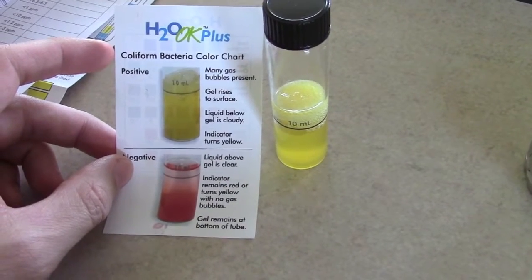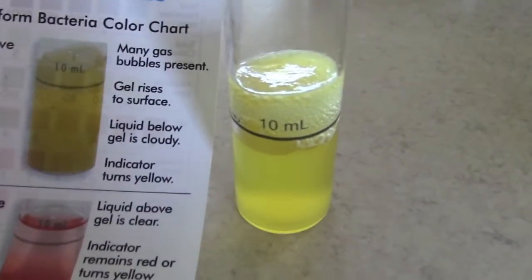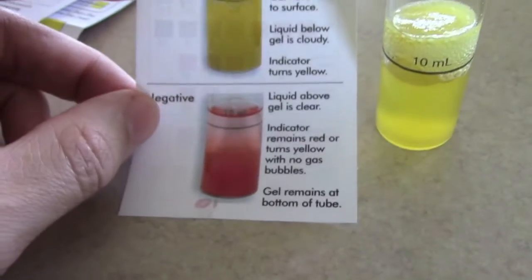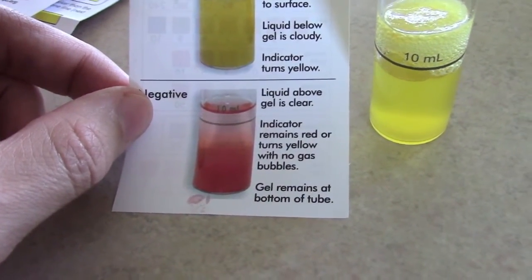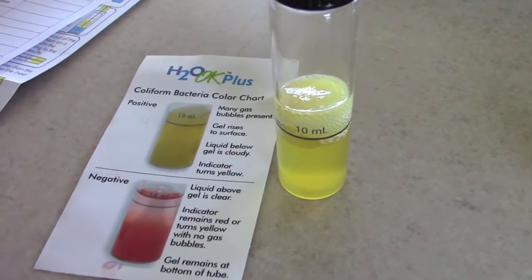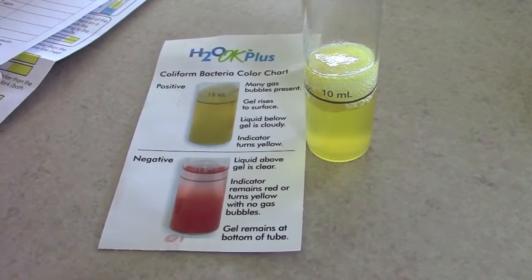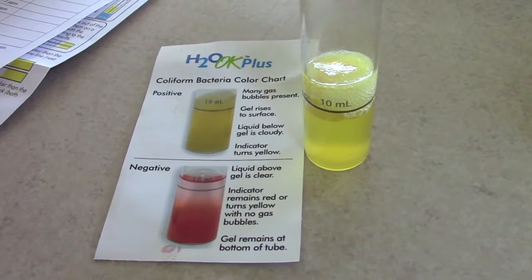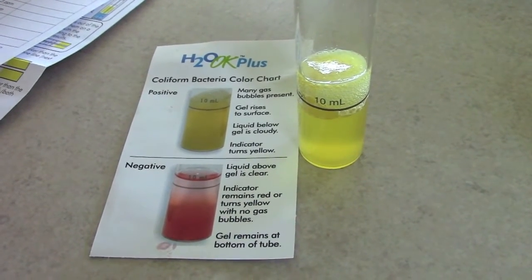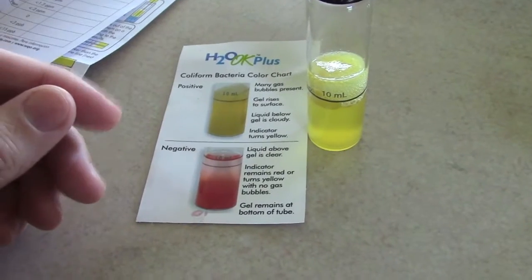It's been 48 hours and unfortunately our well is testing positive for coliform bacteria. You can see the gas bubbles rose to the top, the gel rose to the top — that's exactly what a positive result looks like. It looked negative for the first 24 hours, but then the bacteria incubated and developed. So we're going to have to treat the well with chlorine and put a filtration system on it — that will be a future video. It will be fine for putting on our garden and irrigating, but I can't take a sip out of that hose.